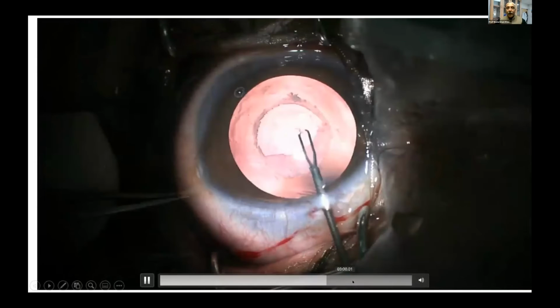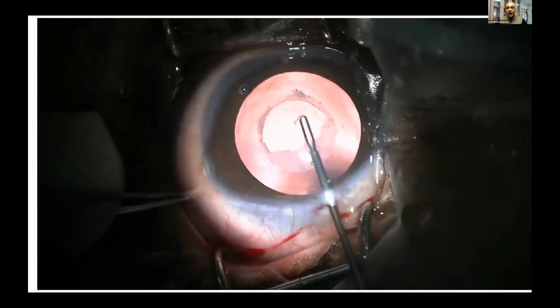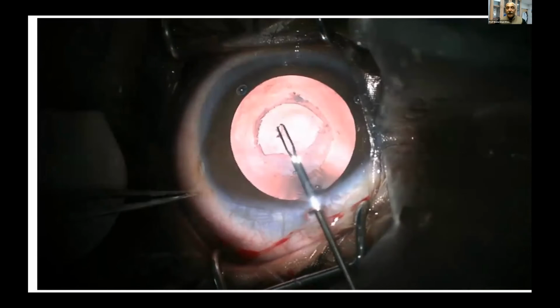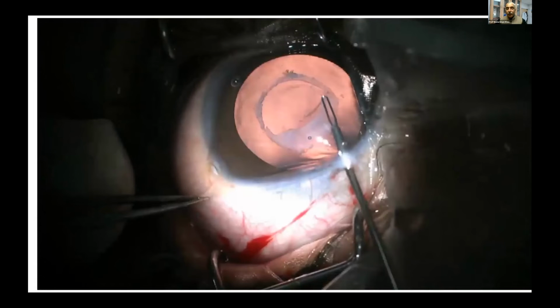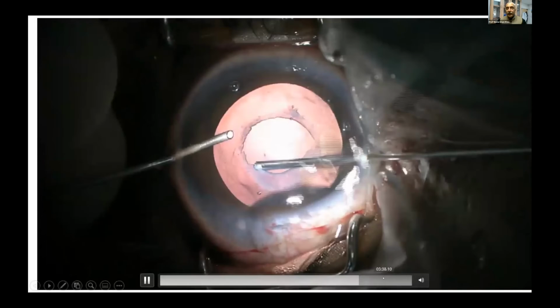Okay. All right. So I'm doing a posterior rexis again, because it's a bigger eyeball. It's very easy to operate. Is it? Because the smaller eye is a problem. Even the bigger eyes can have its own issues when you're handling rexis in these patients. So basically now the posterior rexis is done and the implant goes in.